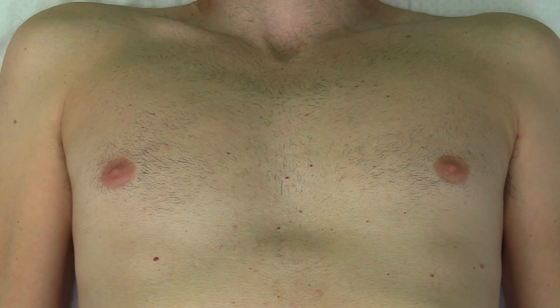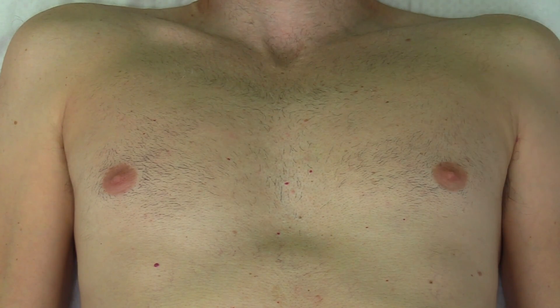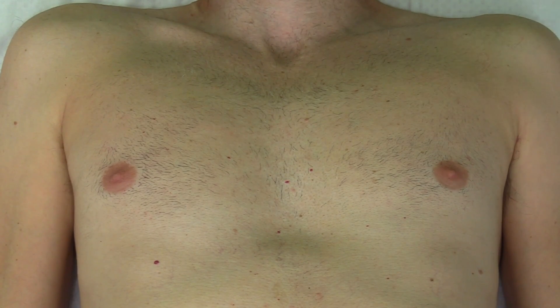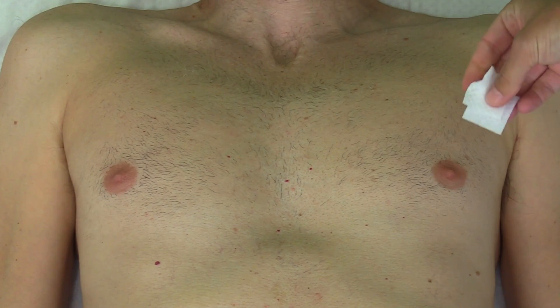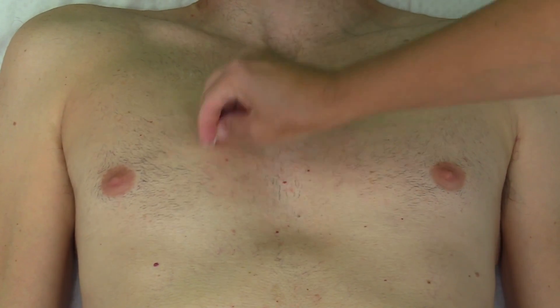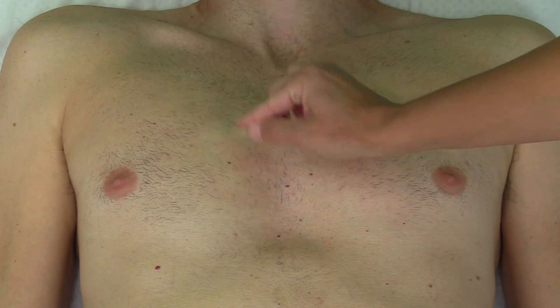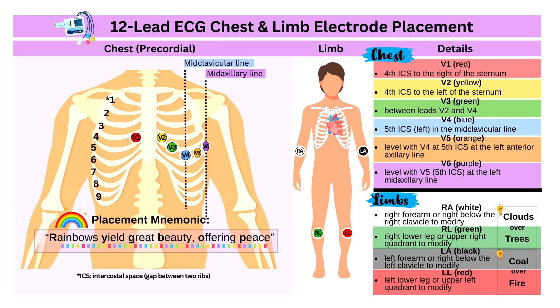After you've positioned your patient, you want to expose the chest. In some patients this is a private area, so you want to preserve their privacy — you can use a towel to cover this area while you work on the chest. Then you want to prep your skin so the electrodes will stick. Get your alcohol prep pads, find your landmark on the chest, and clean the area where the electrode is going to go, removing oils and dead skin. Let that completely dry. Then take some abrasive tape and gently rough up the area — this allows the electrode to get a good connection. Perform this for all the sites where you'll place electrodes.